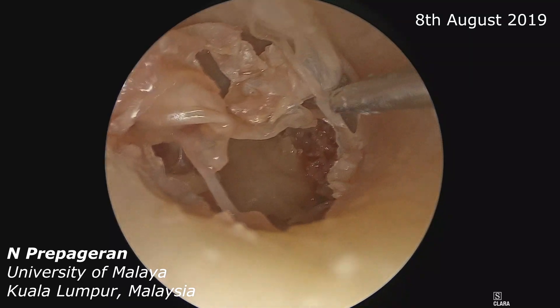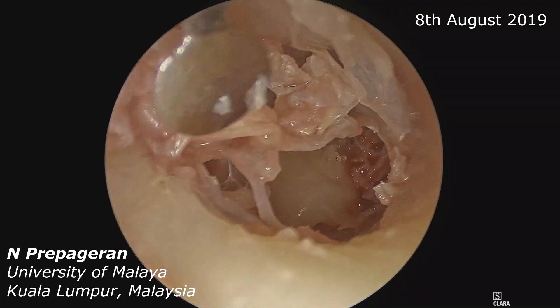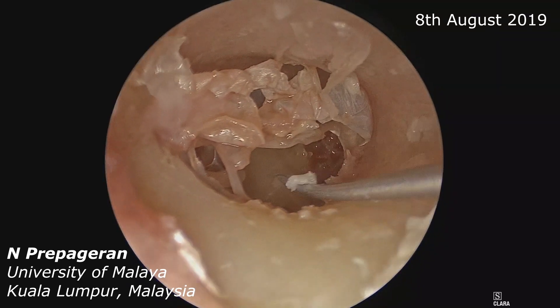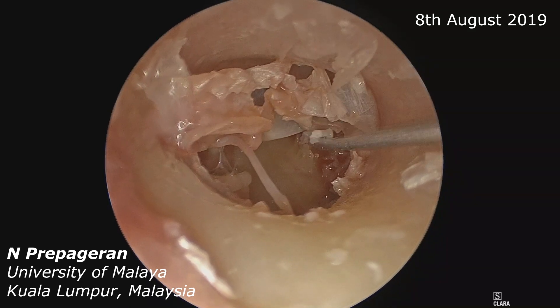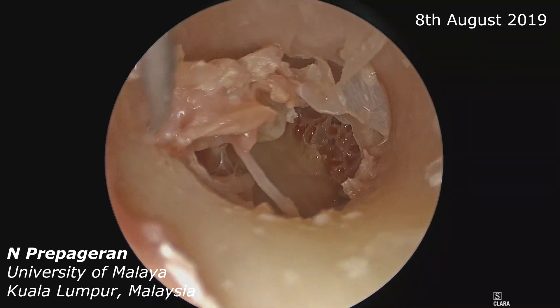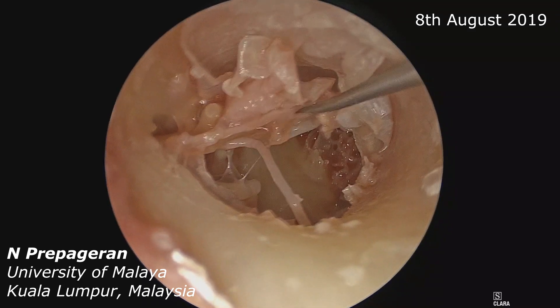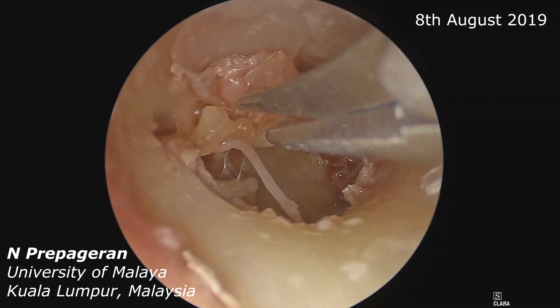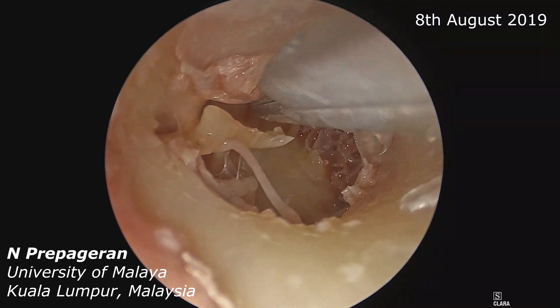Let me elevate the entire tympanomeatal flap. In the same way, I would like to dissect the flap away from the malleus itself. We can see the lateral process. Dissecting the whole thing so that you can see the entire malleus. And that's the umbo — cut the umbo, there you go.